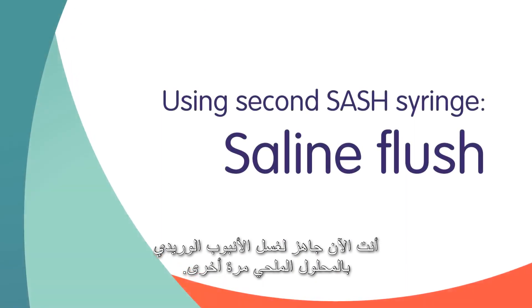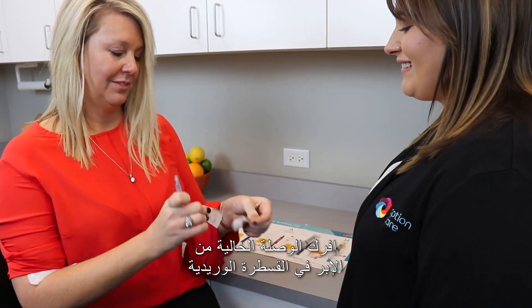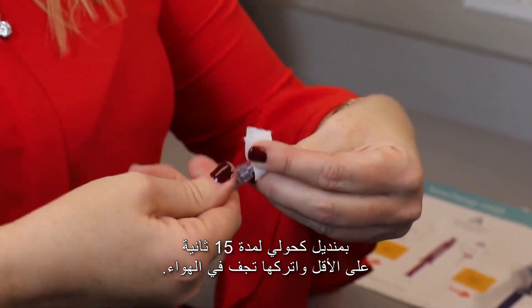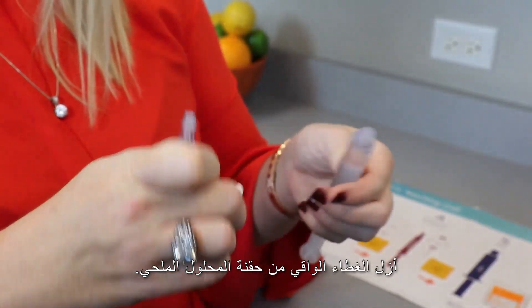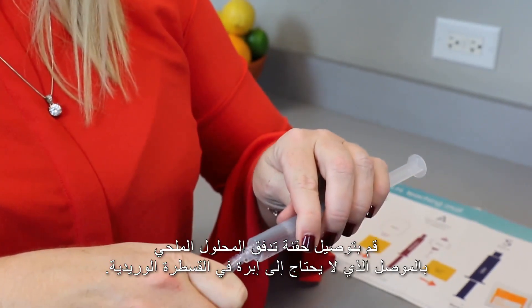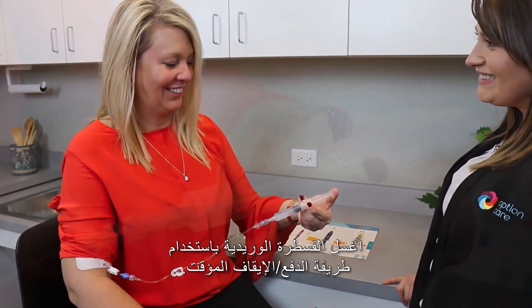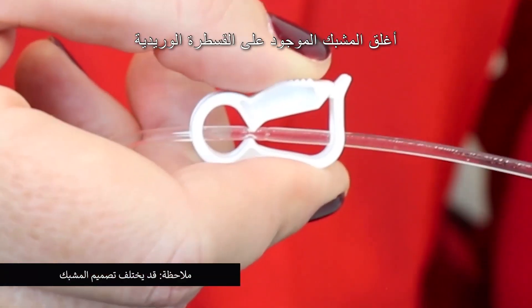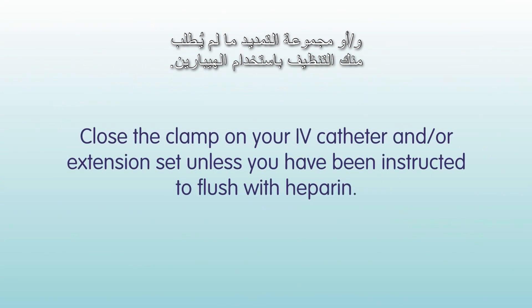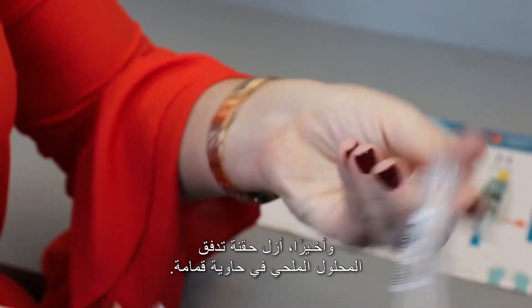You are now ready to flush your IV line with saline again. Scrub the needleless connector on your IV catheter with an alcohol wipe for at least 15 seconds and allow to air dry. Remove the protective cap from the saline flush syringe and attach it to the needleless connector on your IV catheter. Flush your IV catheter using a push-pause method. Close the clamp on your IV catheter and/or extension set unless you have been instructed to flush with heparin. Remove and discard the saline flush syringe in a trash container.